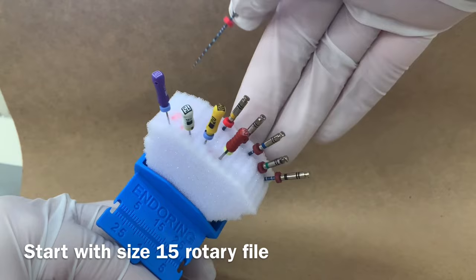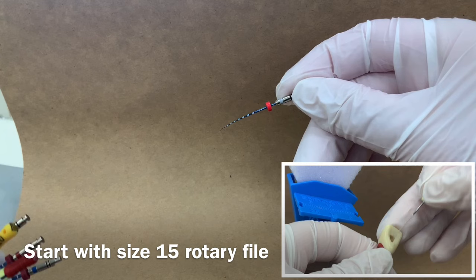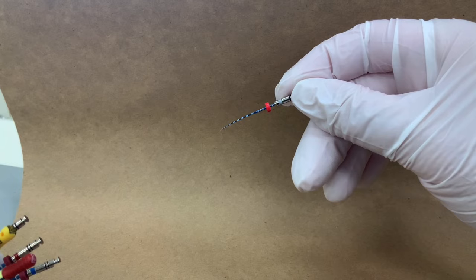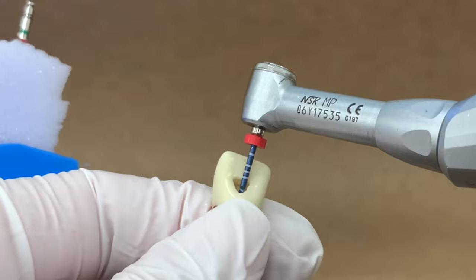Vortex Blue comes in packs of size 15 to 40. Start with a size 15 even though we have already hand filed to size 25. Doing so will allow us to safely negotiate the canal. This file should fit very passively with minimal resistance.